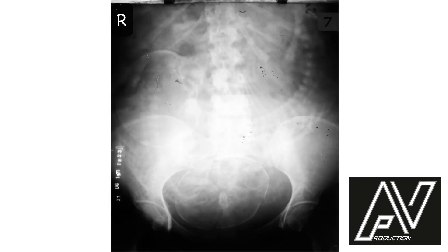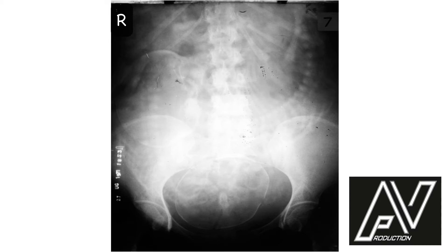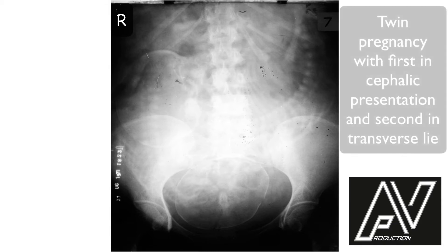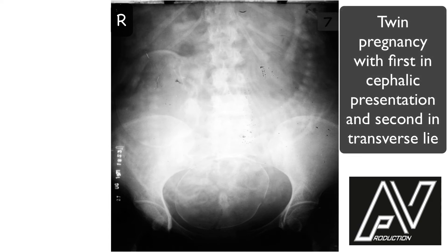This is a plain x-ray of the abdomen and pelvis, AP view, well centralized, well exposed, showing two fetuses. The first twin is in longitudinal lie, flexed attitude, cephalic presentation, and the second twin is in transverse lie, right dorso-inferior position. There is no discordancy in fetal size. There are no obvious fetal skeletal defects. Therefore, my diagnosis is twins with twin A in cephalic presentation and twin B in transverse lie.